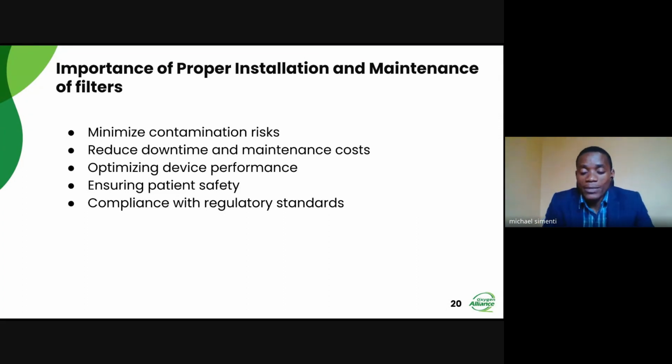What it means is, if we have properly installed the filter, or if we see that the condition of the filter is bad, we need to clean it.